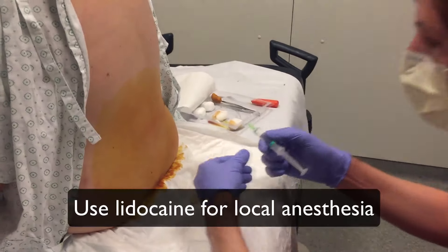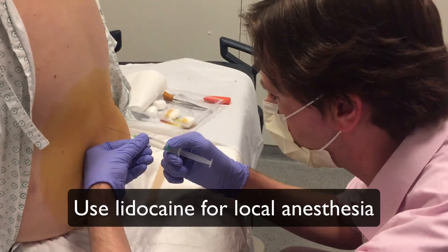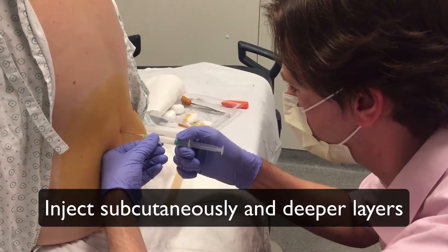Use lidocaine 1 or 2% for local anesthesia. Inject lidocaine first subcutaneously, then infiltrate the deep layers.